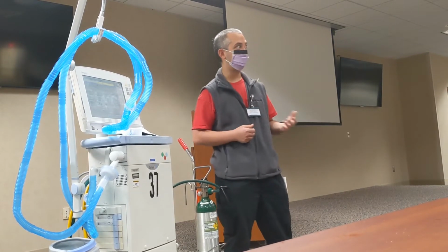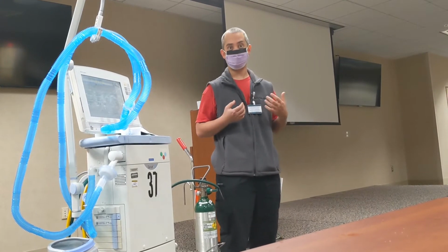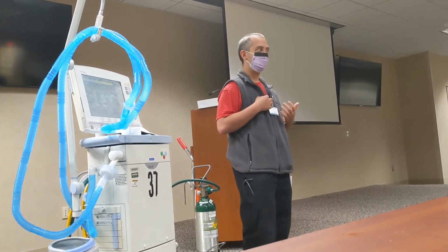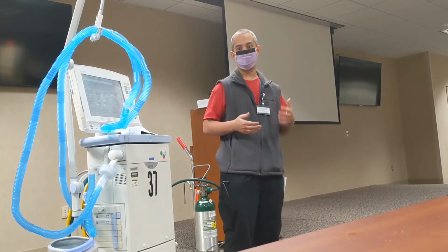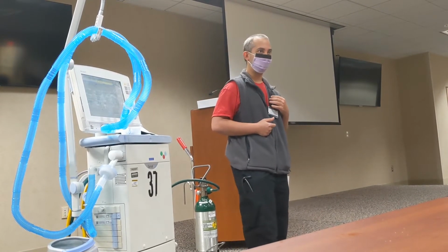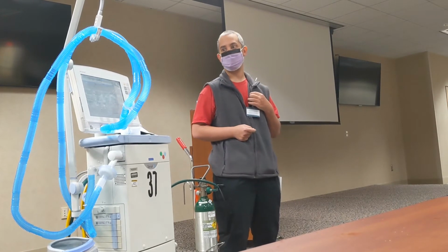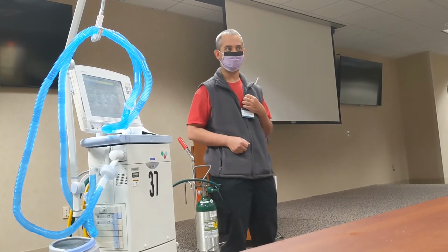And while it's not physiologic to how we breathe, you can also try it out and take a deep breath in for a few seconds, hold it, quickly release, and then breathe in again. And you'll notice that you don't get that air hungry feeling by doing that. So in the same way, even though it's not naturally how we breathe, it's not overly uncomfortable for the patients either. And one of the benefits to that is you're needing less sedation, needing less paralytics, and helping the patient not get all those after effects from all of that.